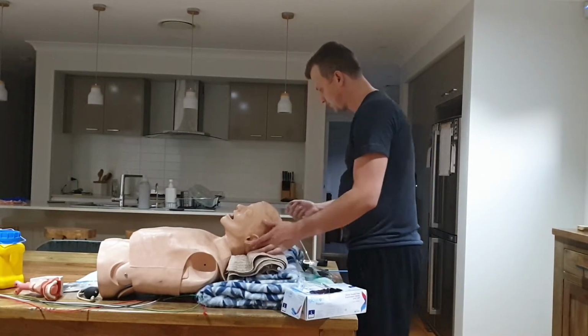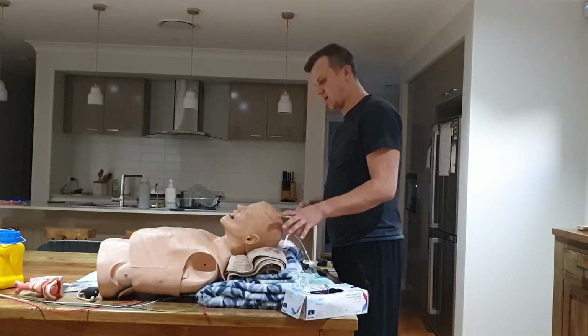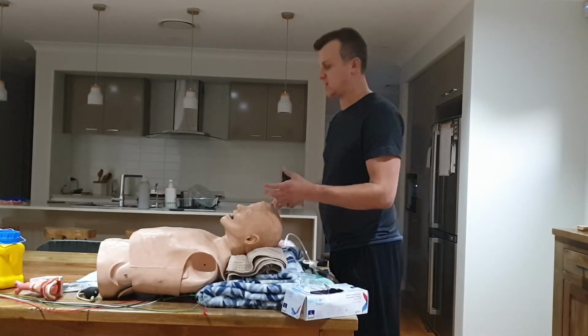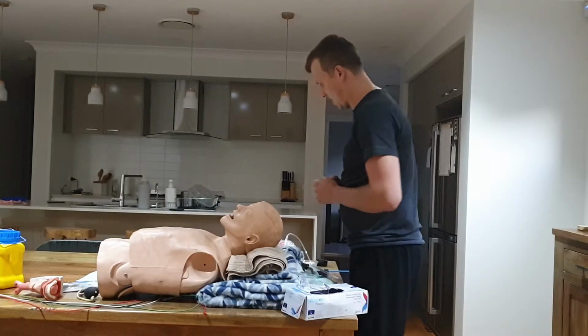Now, safety considerations, again, PPE. Be prepared, you might have to manually ventilate for a long period of time. If you can't intubate, you can provide ventilation through LMA or mask, with full monitoring, and the ideal induction is a rapid onset and rapid recovery.